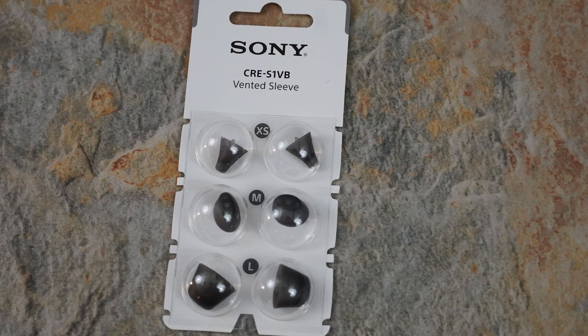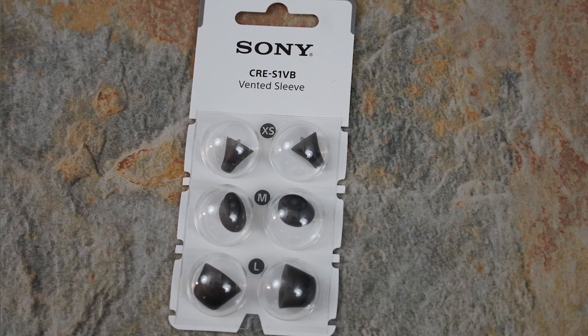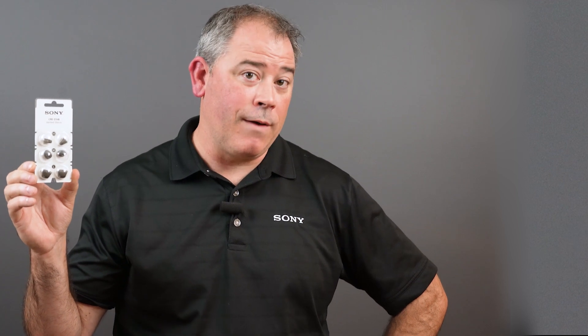Is it too loose? If you're experiencing any of these problems, I have a simple fix for you. Grab the OTC vented sleeves and let's find the size that's right for you.